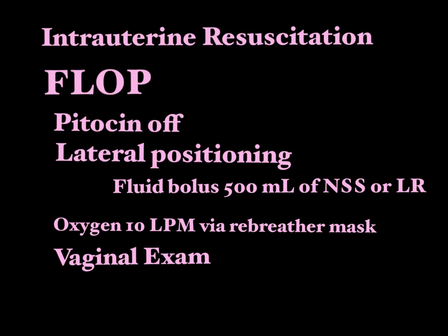On the other hand, if you've been running PIT for 6 hours and mom is still 2 to 3, that's something that the provider should know. That if you're doing all this resuscitation and baby's not tolerating labor and mom's not making progress, you're going to need to let your provider know that as well. But that's basically fetal monitoring and then intrauterine resuscitation, what we do about it. And I'll repeat the intrauterine resuscitation content as we go along. You'll get lots of review on that. And as we do intrapartum nursing, we'll throw in some strips and we'll work with this and play with it in class. But that is about as much as you need to know about fetal monitoring for now.